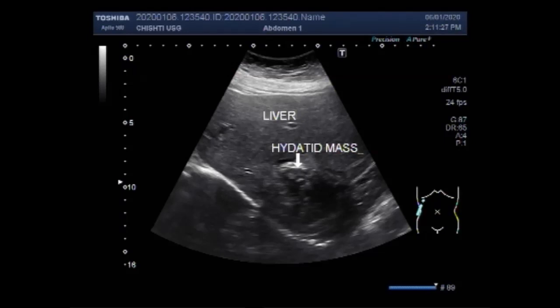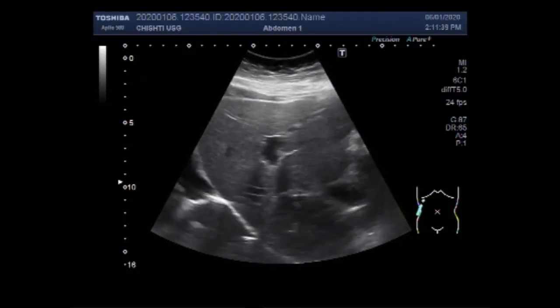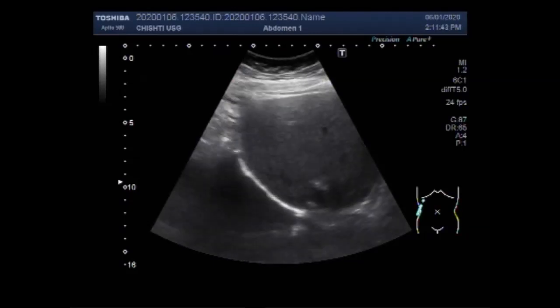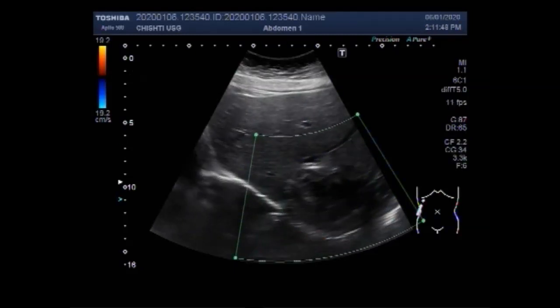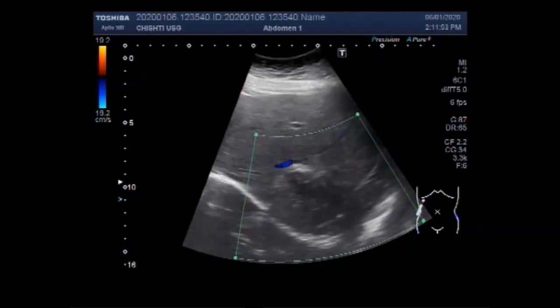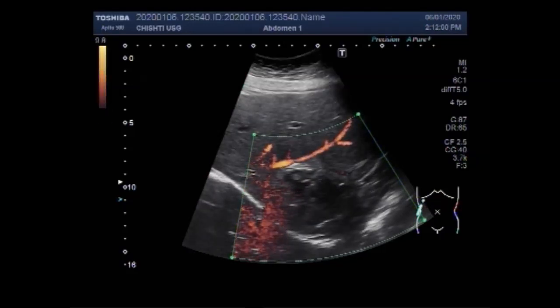This classification was proposed by the World Health Organization in 2001, and the cysts or hydatid mass seen in this video, according to the WHO classification, comes in the stage of CE5 — that is the inactive degenerative stage.